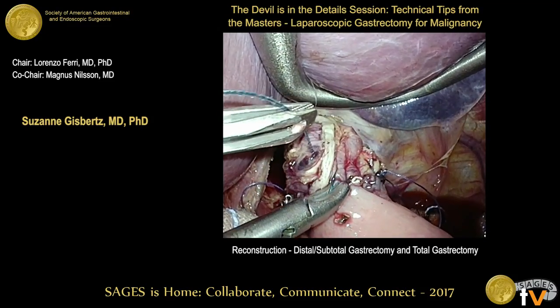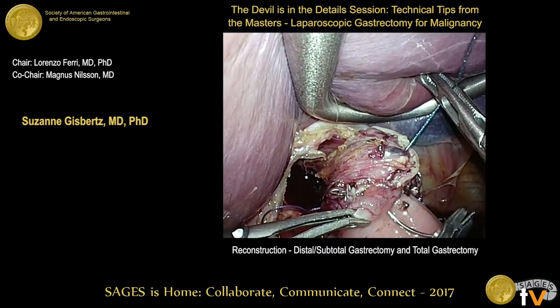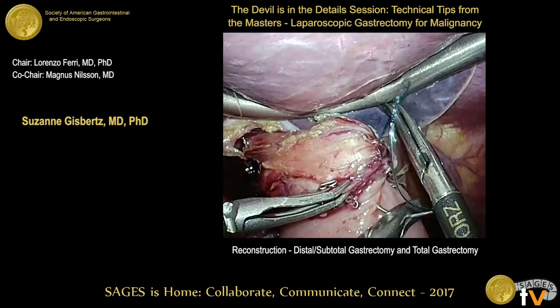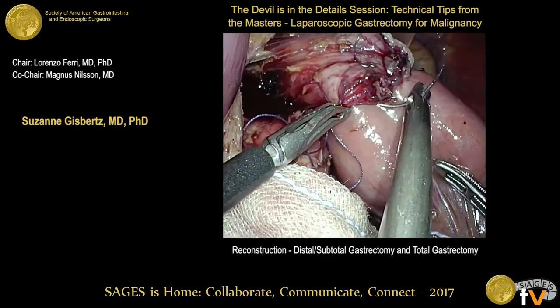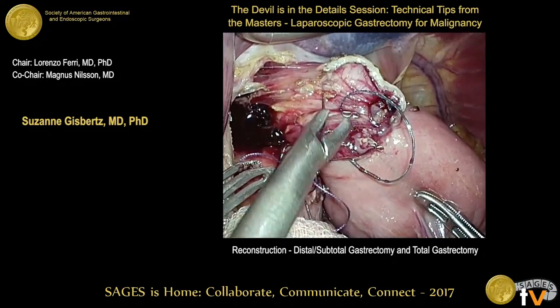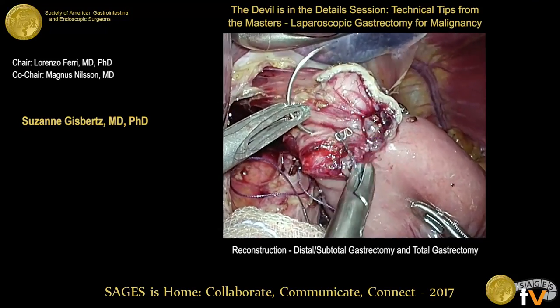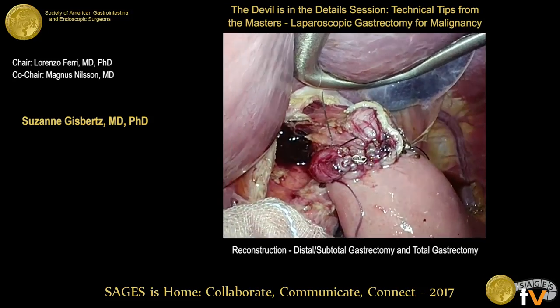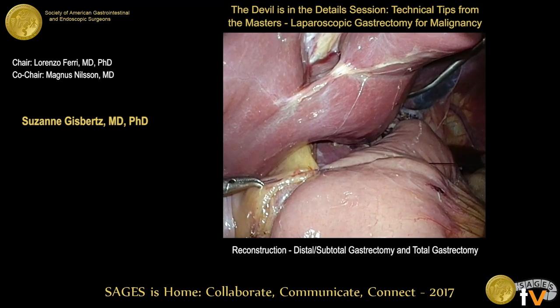A question is raised about using the nasogastric tube as a guide. The surgeon confirms: yes, just as a guide to insert the limb of the linear stapler appropriately, not to dissect under the plane of the mucosal layer. Finally, he prefers to fix the jejunome to the hepatoduodenal ligament to prevent twisting of the jejunum after gastrectomy.